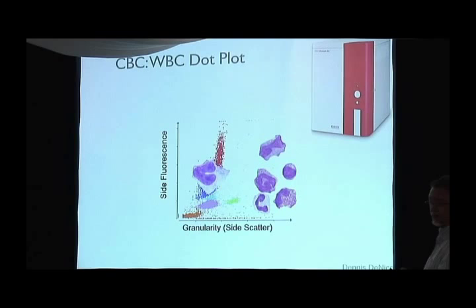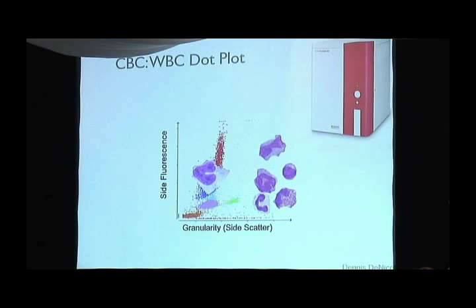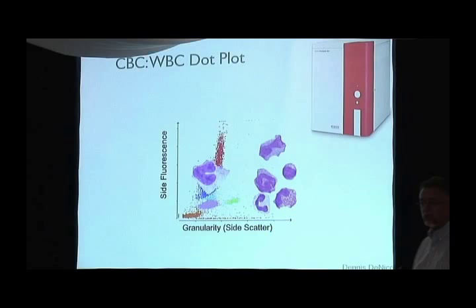So here's what happens. The instrument is gonna run this sample, all right? And I'm gonna show you what happens here in a minute. And it's gonna encounter this dude or dudette, whatever it may be. And it will say, I'll be darned. You know, it kind of looks like a neutrophil, but it glows like a lymphocyte. Or it glows so much that it glows like a monocyte, okay? But I am not sure if it's a lymphocyte or a monocyte, okay? So how is it going to communicate that to us? I'm gonna show you here in a second. So let me show you this graphic.